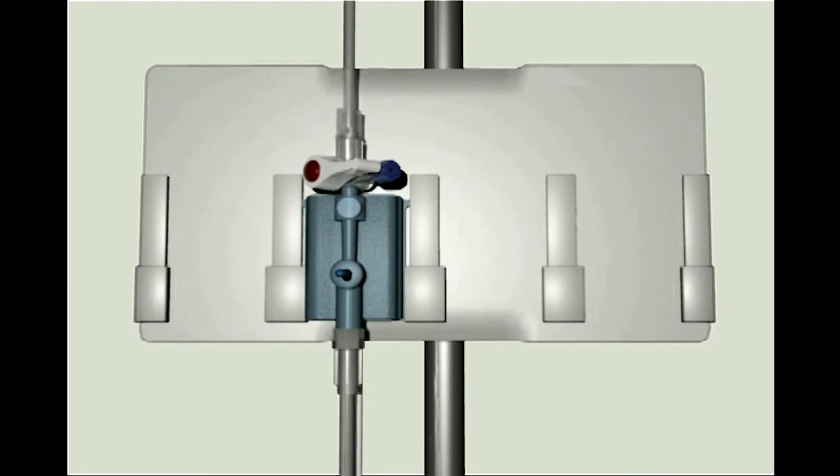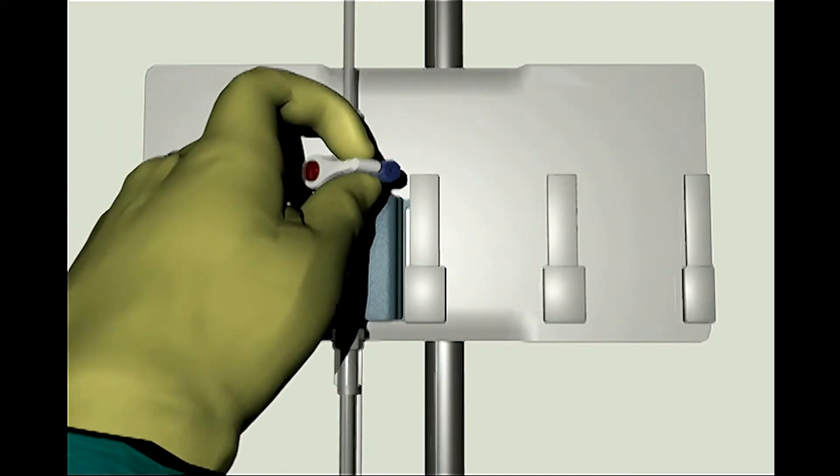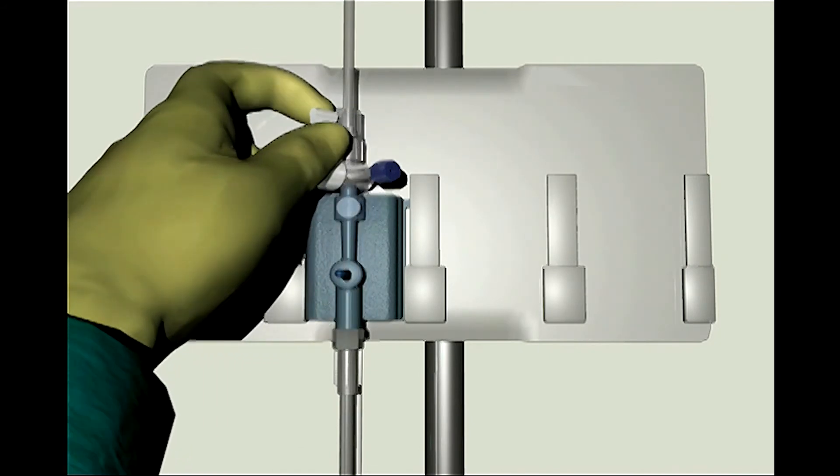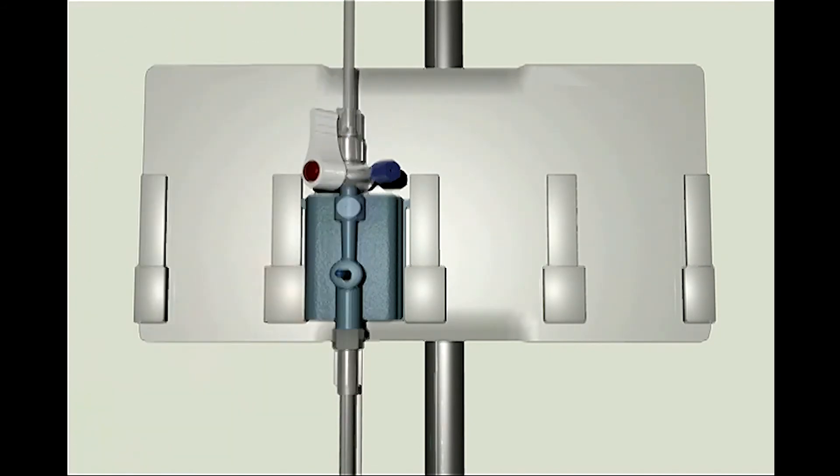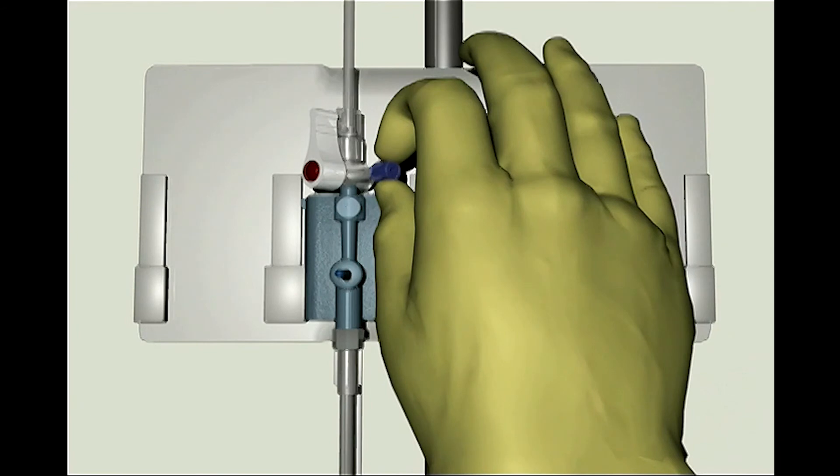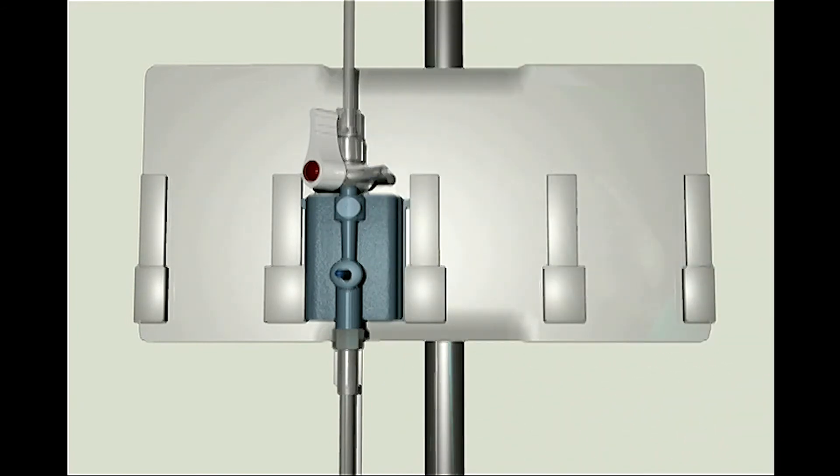The TruWave transducer must be zeroed to remove the effects of atmospheric pressure. Step 3: Open the stopcock above the transducer to atmospheric air by turning the stopcock toward the patient's pressure tubing and away from the TruWave transducer. Then remove the non-vented cap. Perform this maneuver while maintaining sterility of the cap and stopcock port.